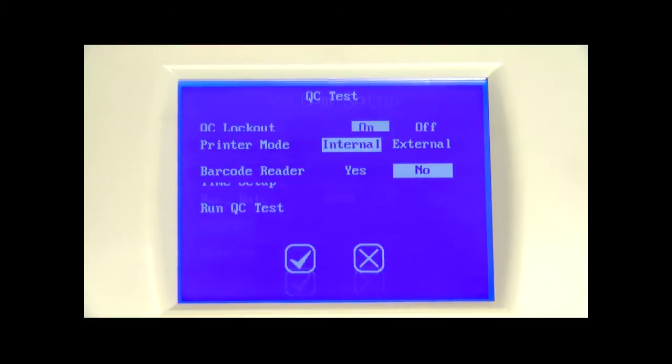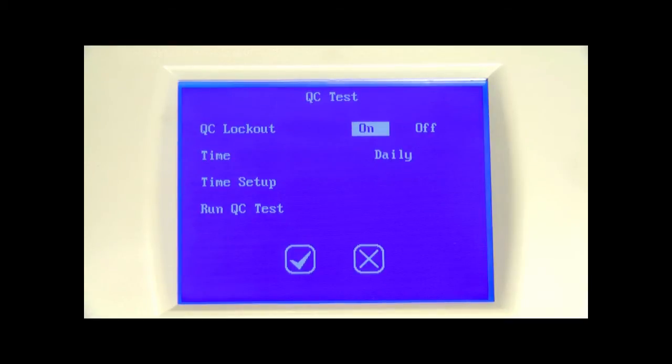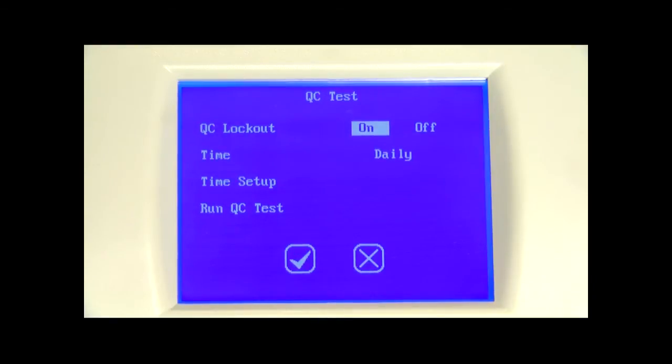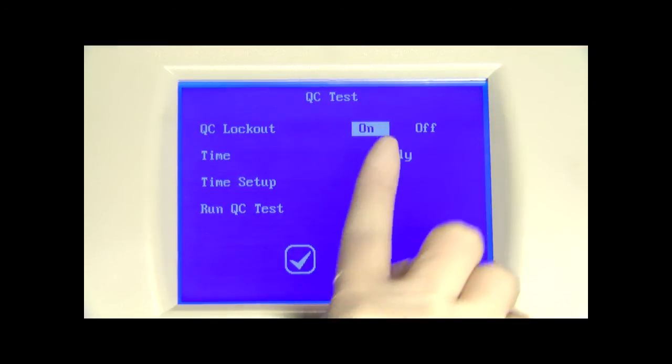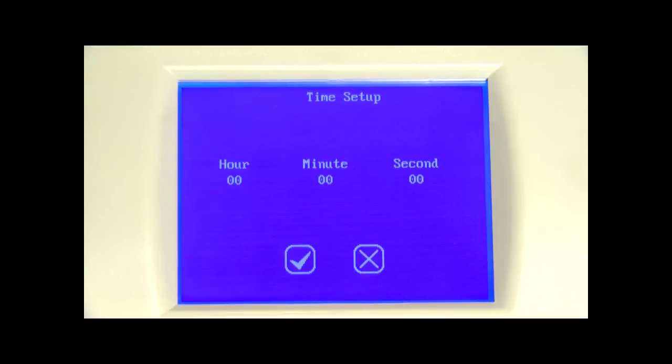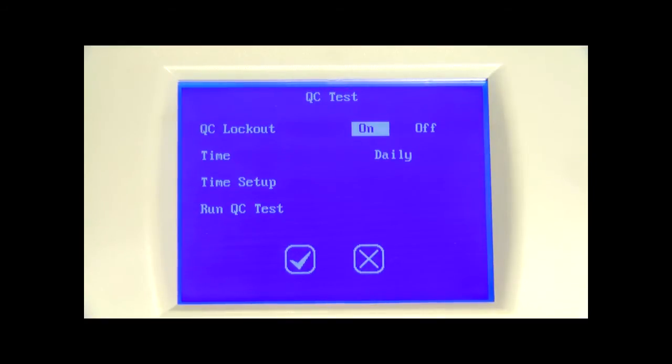Press QC test and then press on to show the QC test screen to set, review, and perform a QC test before the next scheduled test time. Press QC lockout to turn QC lockout on or off — the selection will be highlighted. Select time to set the QC test time for every 8 hours, daily, weekly, or monthly. After selecting time, select time setup and press the check mark to set the QC testing time. Press run QC test to perform a QC test before the next scheduled test time.